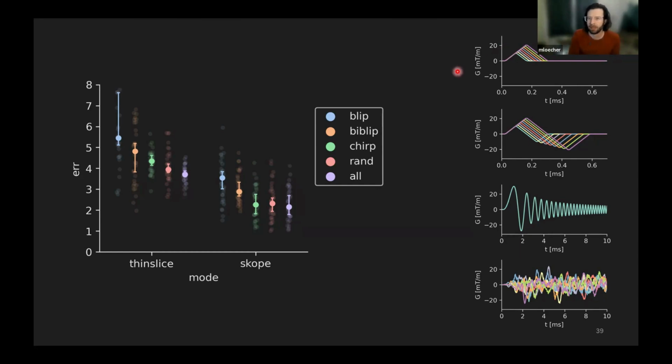We also did kind of the same thing, but with bipolars. I've never seen this done, and there wasn't a great reason to do this other than we care about our bipolar gradients. So maybe measuring a GIRF specifically with bipolar gradients might be helpful, so we wanted to test that out.